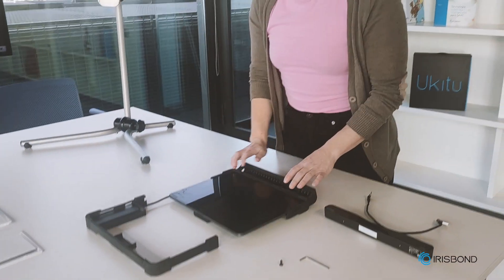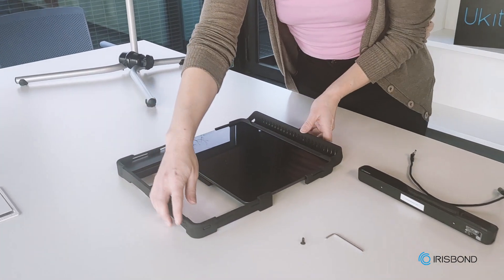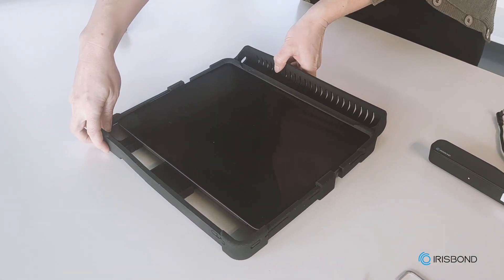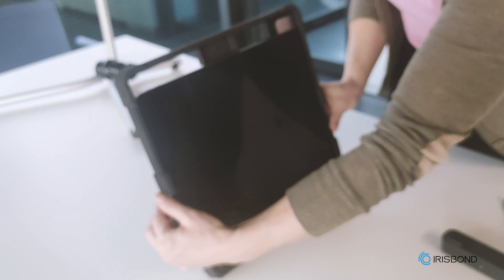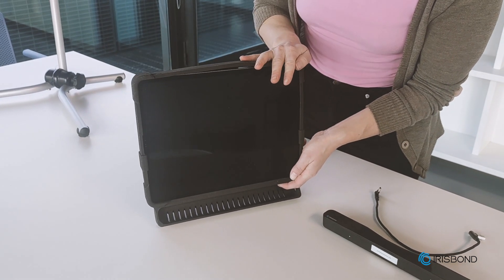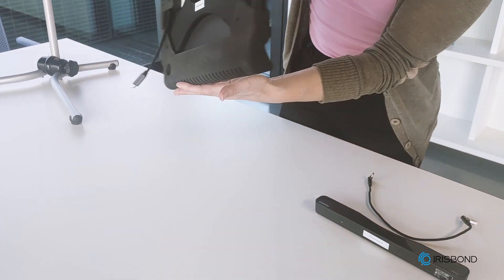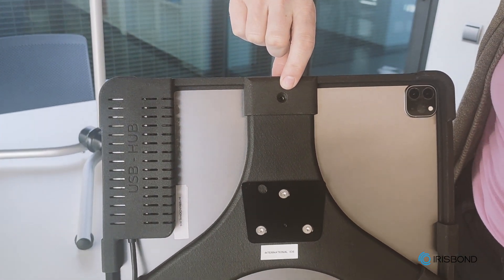Now we put the two pieces together. I'll take my top piece, put it next to my iPad, and just slide it down. There are a few pieces so it just takes some coordination. Now that I have the top part in place, I push it down over the iPad and make it fit snugly. Our two pieces have come together, and now I need to replace the screw.